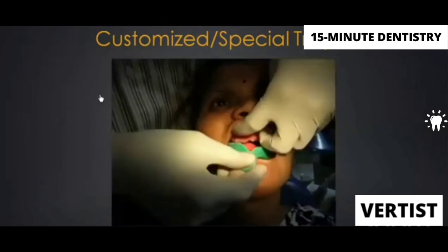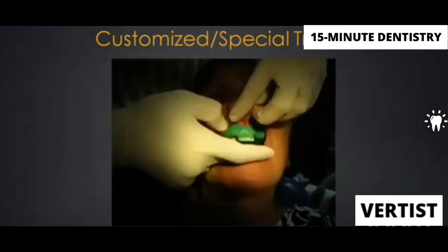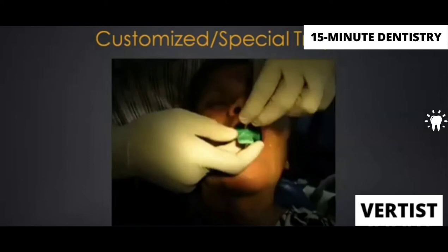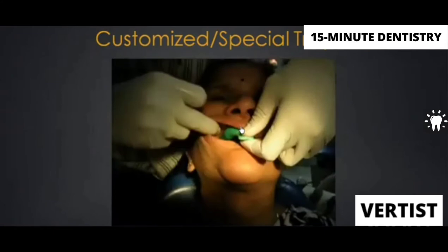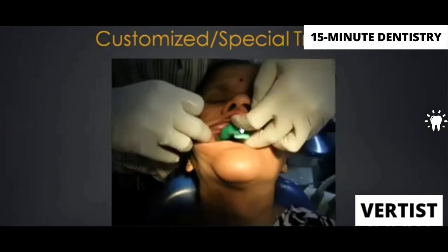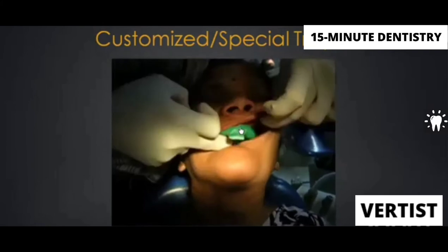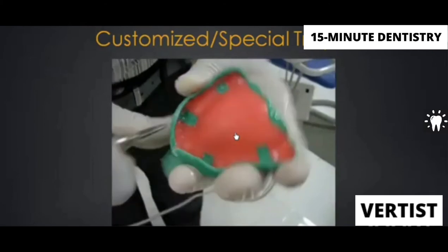So the operator, if you see, is behind the patient. Slowly retract, don't hurt the patient. Once you have placed it, retract nicely and then check whether there is sufficient space. Here the space for the frenum is deficient. You need 2 millimeters of space for the green stick material all around, including in the frenum region. Okay, so that is very important. Check in all the frenal regions, in all the vestibular regions, whether 2 millimeters of space is there, except in the PPS. Posteriorly, your tray should extend right up to the posterior vibrating line.